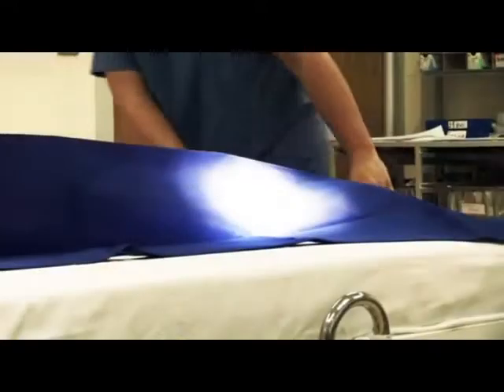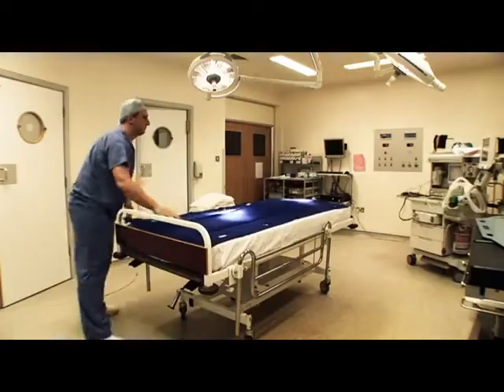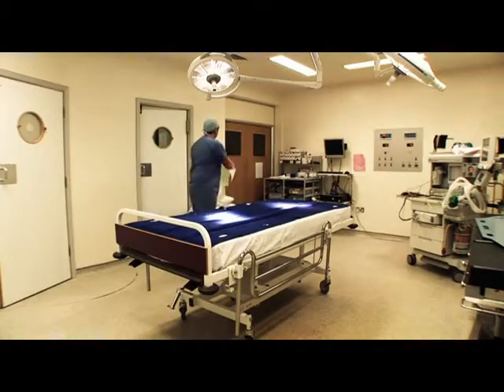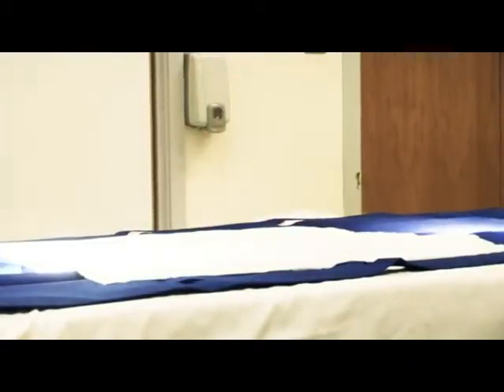Because it is latex-free, FlexiSlide also avoids any risk of allergic reactions. Furthermore, the material is water-resistant, maintaining its strength when wet, so requires no change in current practice.